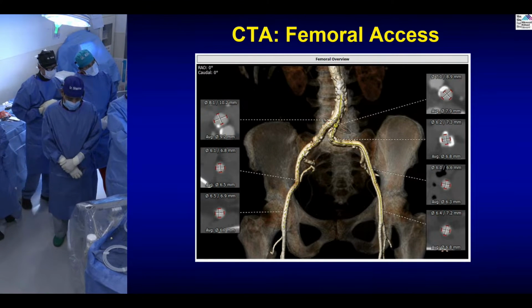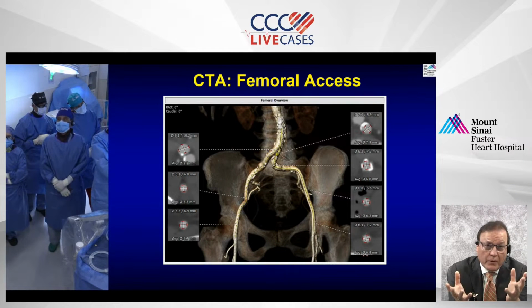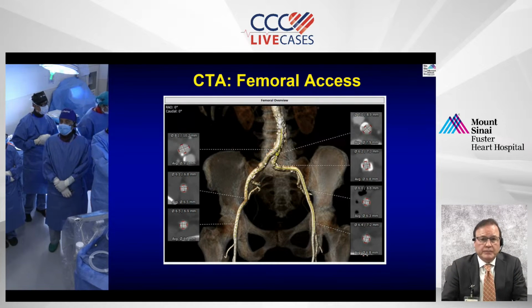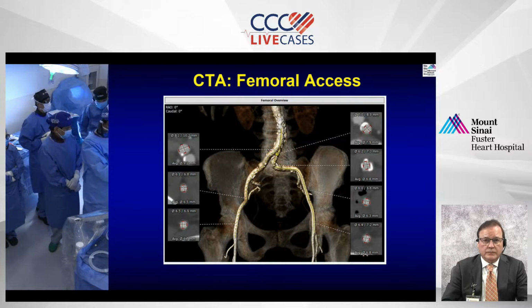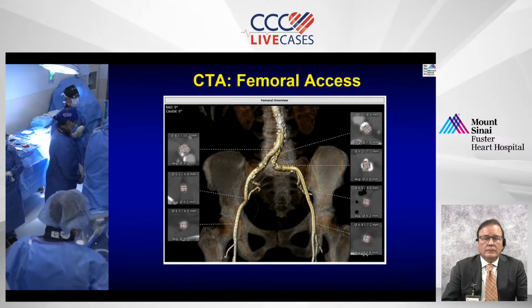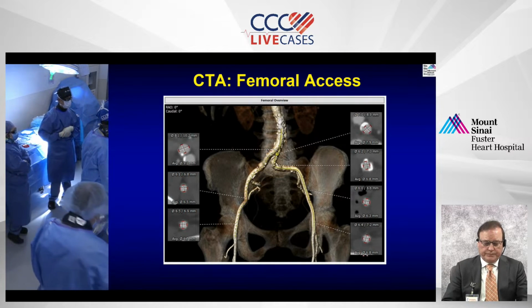Yeah, let's say if we hampered the left main with the balloon valvuloplasty, then we probably wouldn't do a second valve. I mean, just anticipating things in the worst case scenario. I think we should be okay with the balloon dilatation because you see the white line sign is still quite far based on our current left main angiogram. Absolutely. Yeah. Let's do the pre-dilatation first.